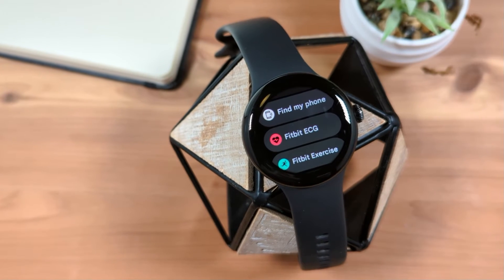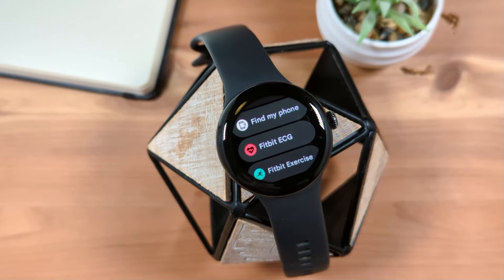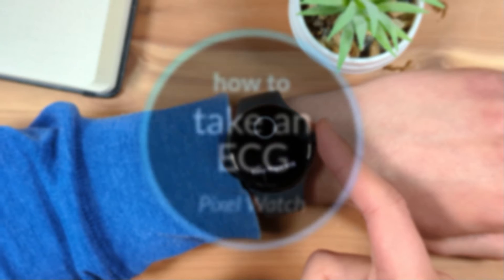In this video, we'll look at how you can take an electrocardiogram, or ECG, on your Google Pixel Watch, as well as how to access the ECG report in the Fitbit app.